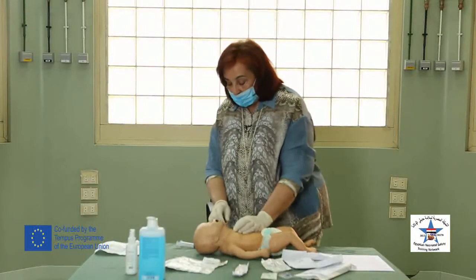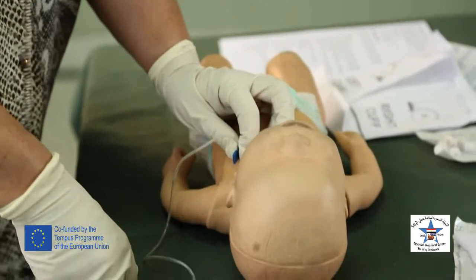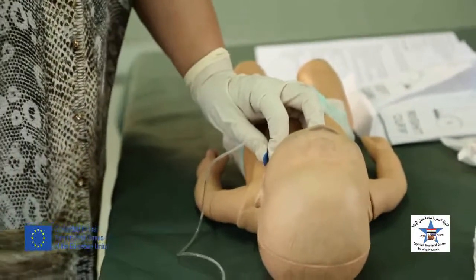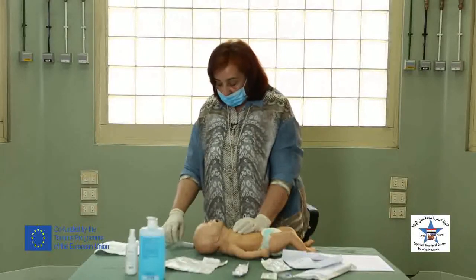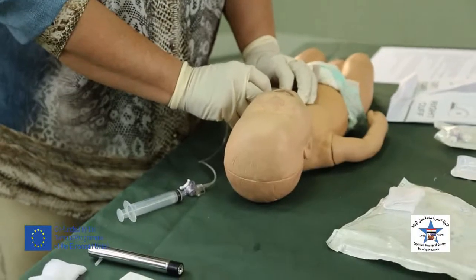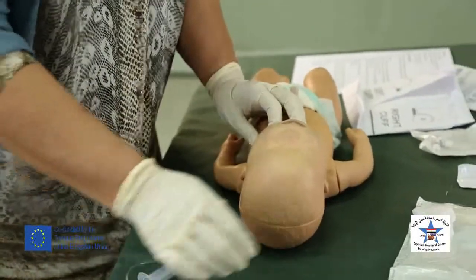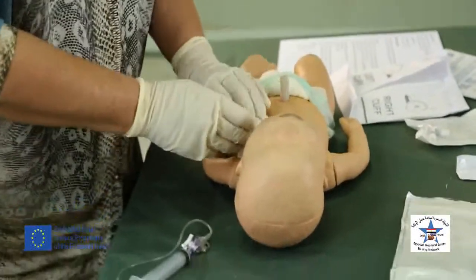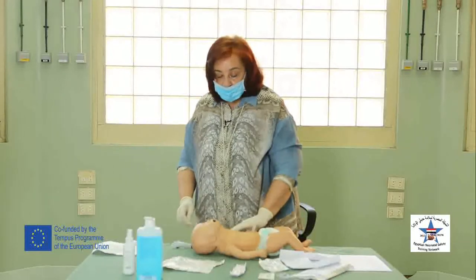I will listen for the air entry on the affected side. Better air entry should be there now. And I will look at the oxygen saturation and the vital signs of the baby. If it is improving, then I have emptied the air from the pleural space. I remove the butterfly needle and I will apply petroleum-soaked gauze over the site of insertion, or I can use a gauze soaked with Vaseline.